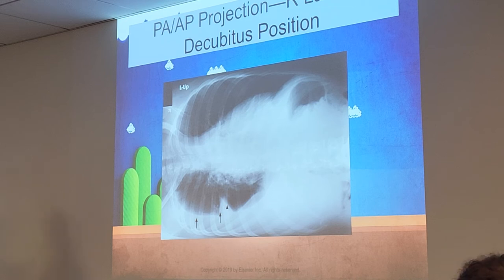The head is right there, right? On the left. Head's right here. So we're laying like this, and they'd be facing us. They were facing us, but their chin is raised a little bit because they need to see the trachea.